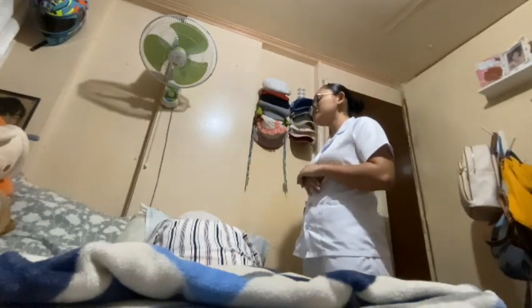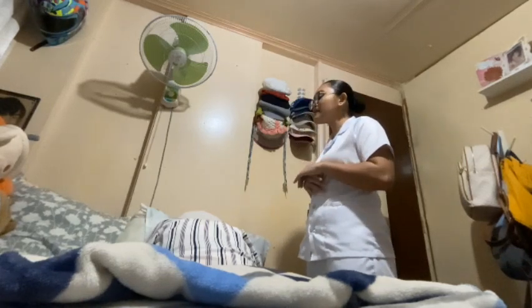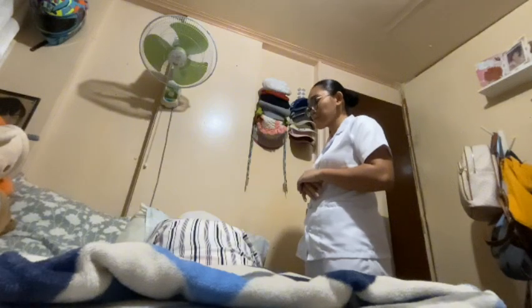So today I'll be doing catheterization. I will just be inserting a small tube into your bladder to help drain your urine. This will make you feel comfortable and also help us monitor your condition. The procedure might feel a little uncomfortable down there, but it should not be painful. I'll make sure to keep you safe and comfortable while I do it. Do I have your consent to proceed, ma'am?